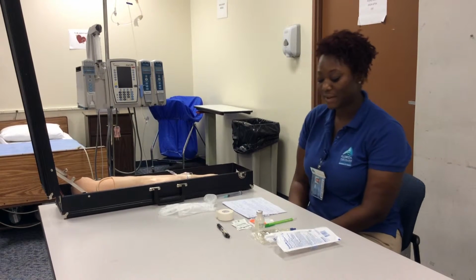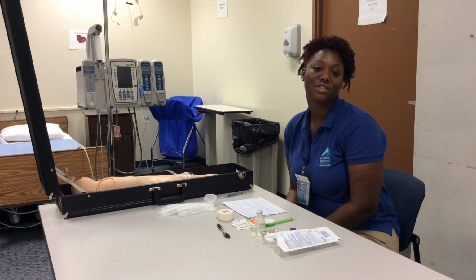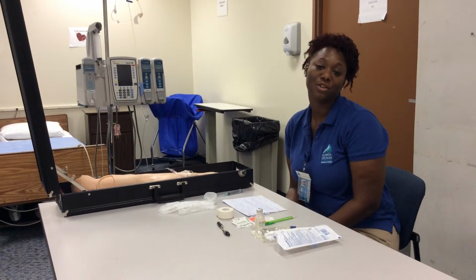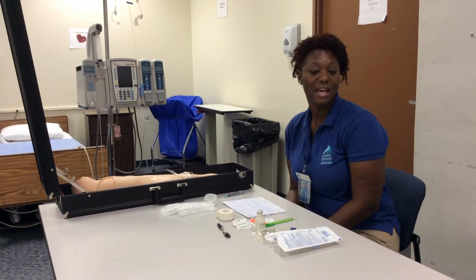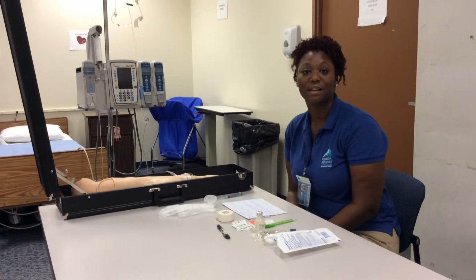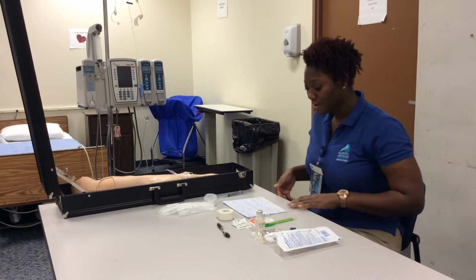So first, what I need to do is verify doctor's orders. I'm going to make sure I have the correct medication, the dose, the route, and the frequency, and then I'm also going to check the patient's lab results and check for any history of allergies. Next, I'm going to be reviewing my information on my medication.